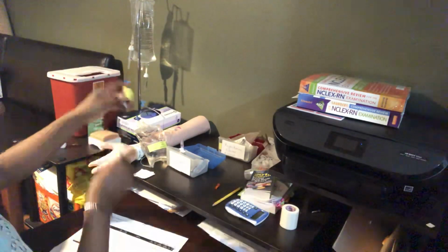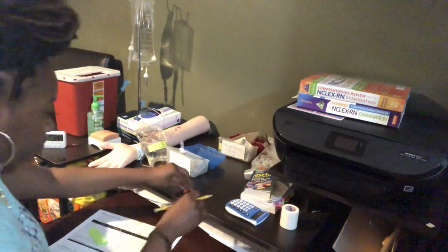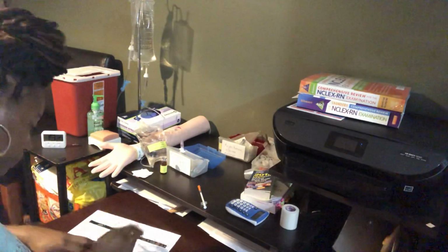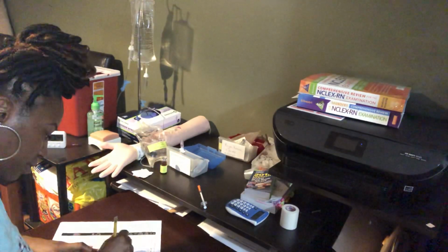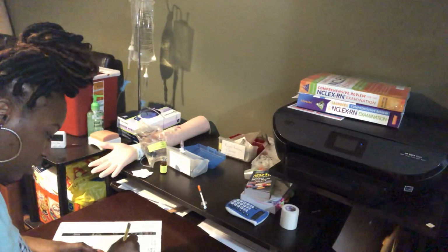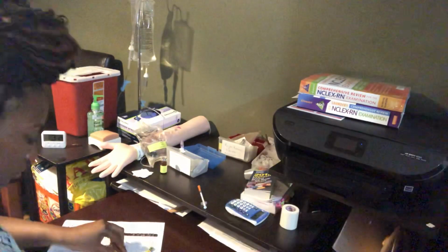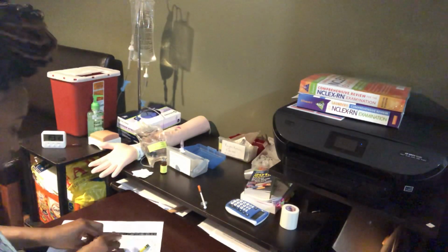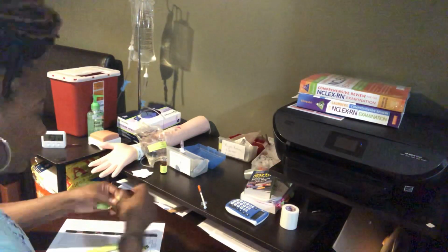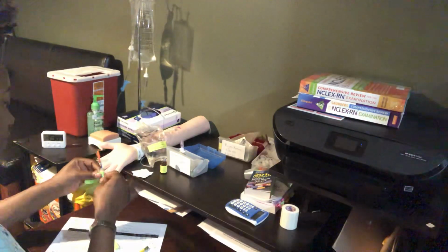10 units. Label. Top on there. I got regular insulin U100, and I got 10 units in my syringe. Okay, so I'm gonna go ahead and label that, so I want no problems.